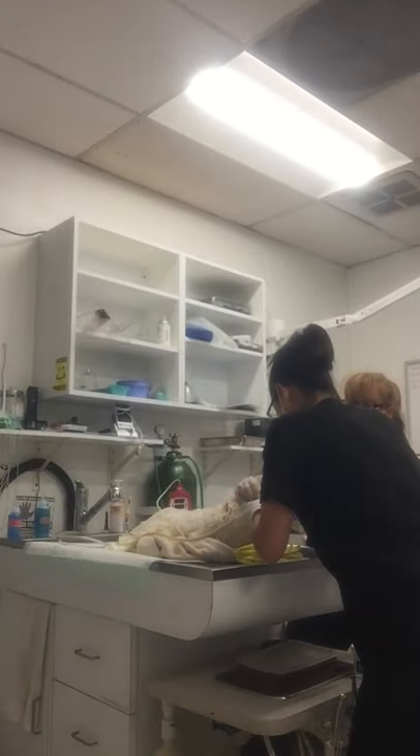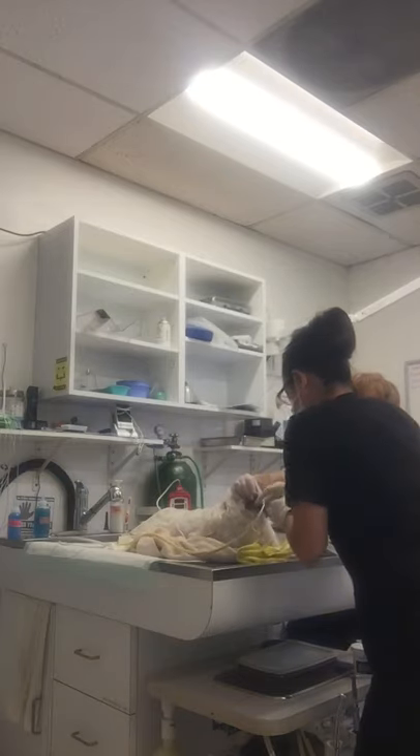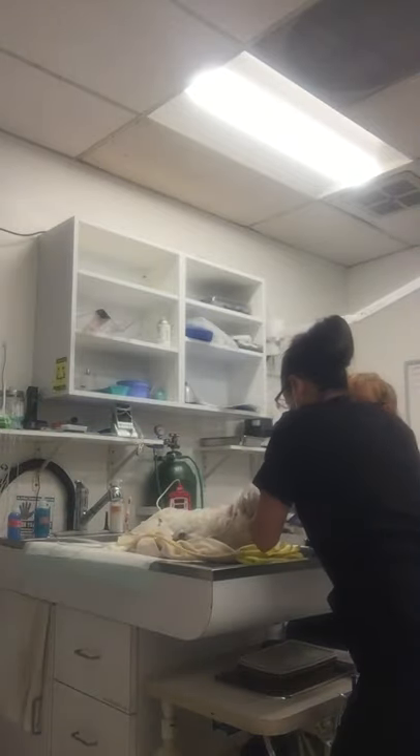We're going ahead and placing it in. I have my remembered mark here and we're going to stop right about there. Remove the laryngoscope. Then we can lower the head and drop that down.